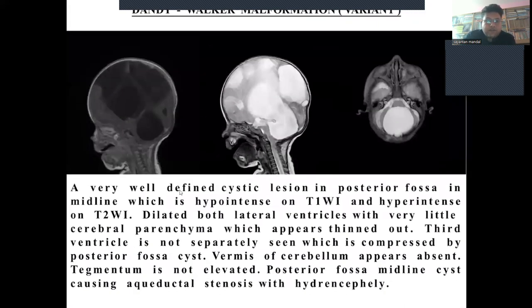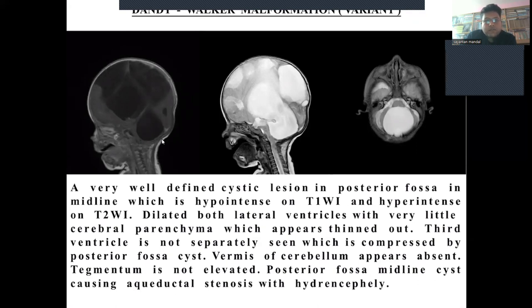In this case, a well-defined cystic lesion is noted in the posterior fossa in the midline, which is hypointense on T1 and hyperintense on T2. Dilated lateral ventricles with very little, thinned cerebral parenchyma are noted. The third ventricle is not visualized and is compressed by the posterior fossa cyst. The vermis of the cerebellum is absent and the tegmentum is not elevated. The final diagnosis is a posterior fossa midline cyst causing aqueductal stenosis with hydrocephalus, consistent with a Dandy-Walker malformation variant.